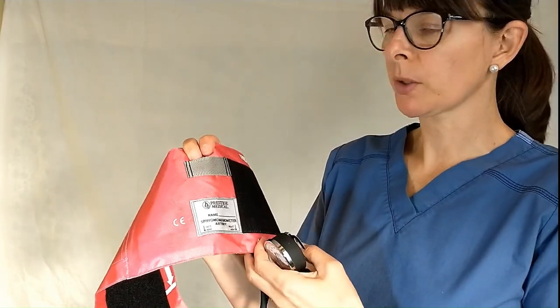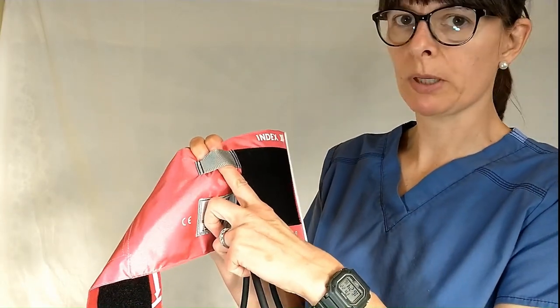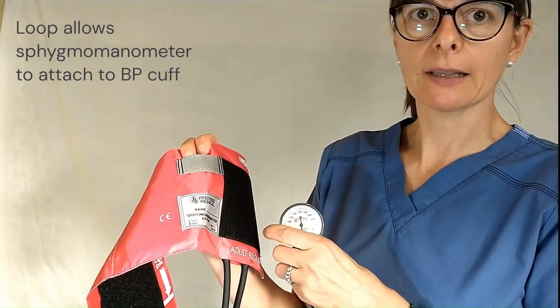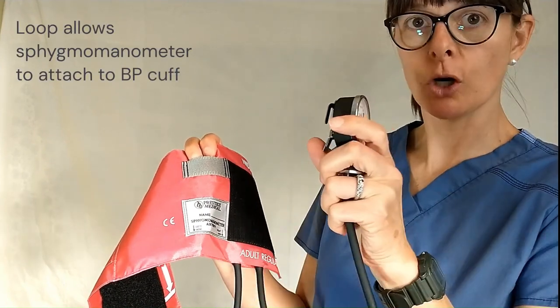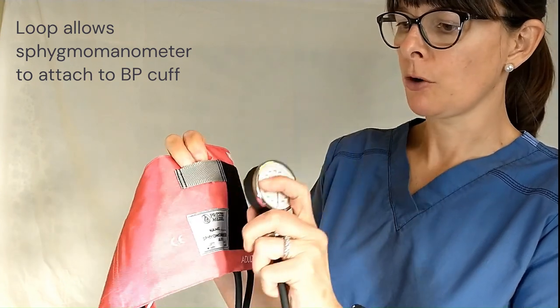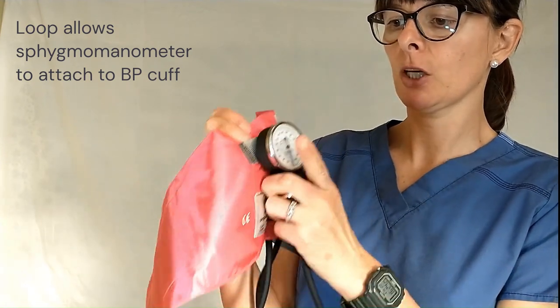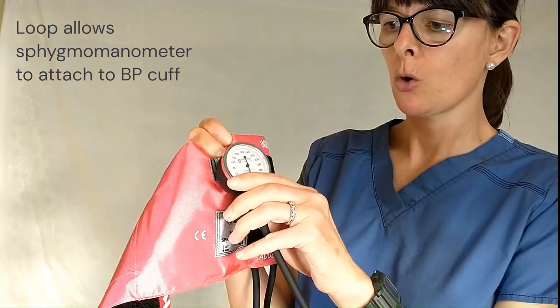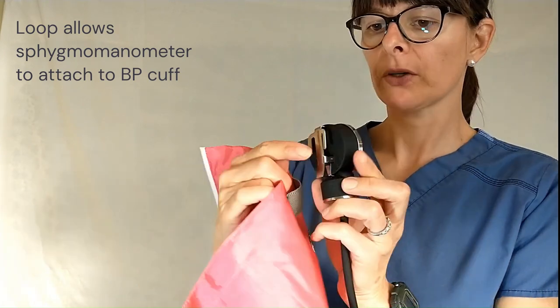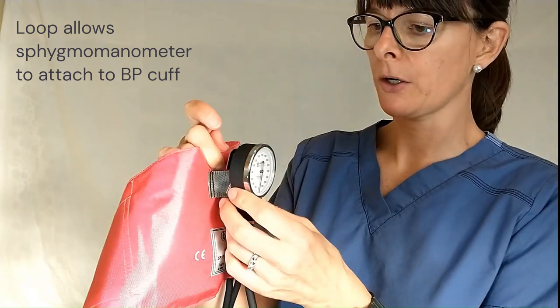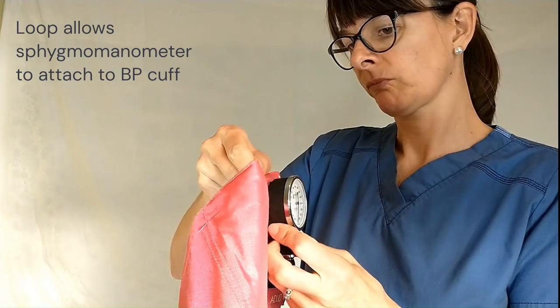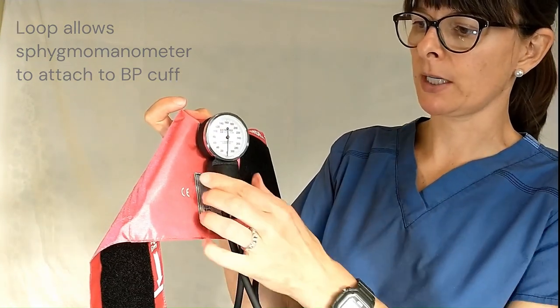And then one more part we need to discuss is this little loop here. So this is actually a nifty little device because you can hook the sphygmomanometer either from the bottom with the hook in here and hold it in place, or if you prefer there are these two little prongs back there. You can actually hook it this way and it'll sit right here.